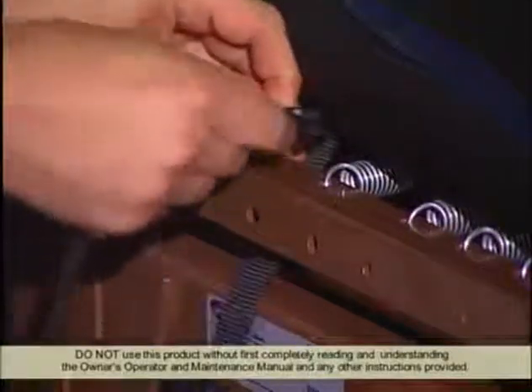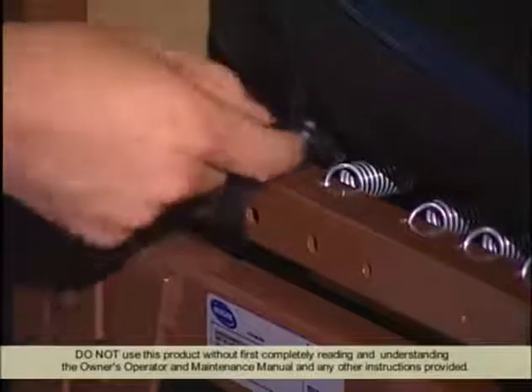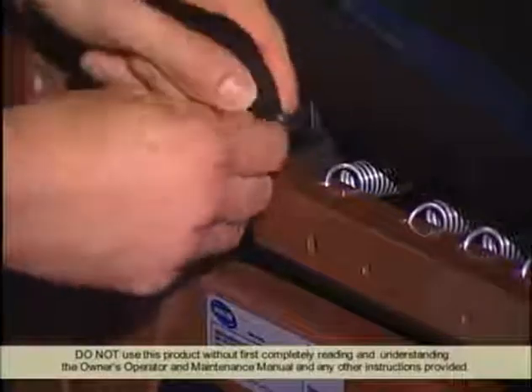Lace the strap through the 2 loops. Separate the loops, then bring the strap over the top of the first loop and lace it underneath the second loop. Pull the strap tight to cinch it down, and the mattress will be secured to the bed.